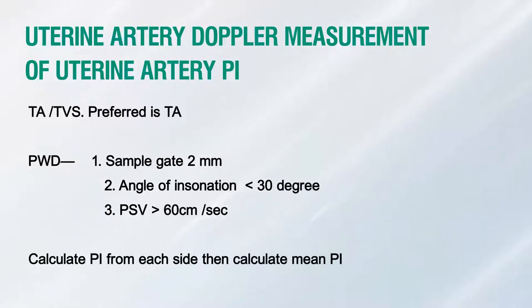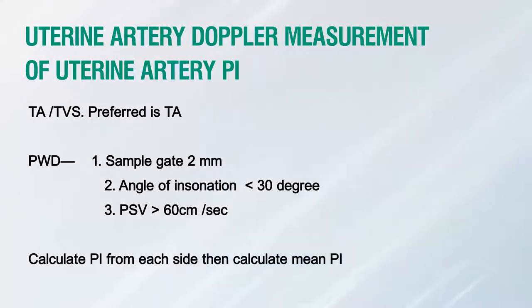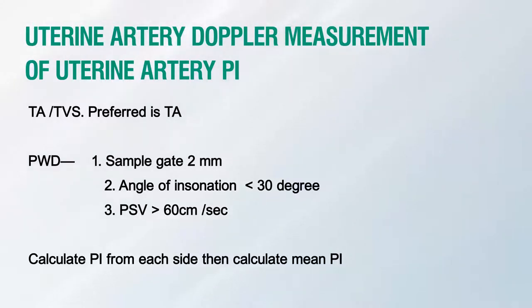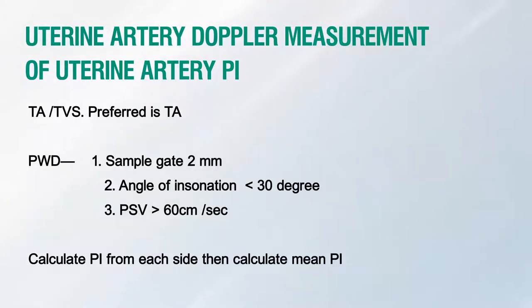For obtaining pulse wave Doppler, the sample gate should be two millimeters with an angle of insonation of less than 30 degrees. The uterine artery is identified by its typical signature and a peak systolic velocity of more than 60 cm/s. A PSV of less than 60 cm/s indicates we are examining the arcuate artery rather than the uterine artery. Minimum three consecutive waveforms are obtained and the PI is calculated automatically by the machine. We take PI from each side, calculate the mean PI, and a PI of more than the 95th percentile is abnormal.